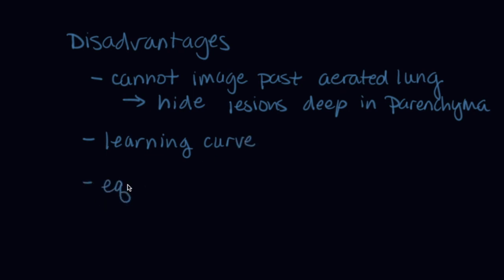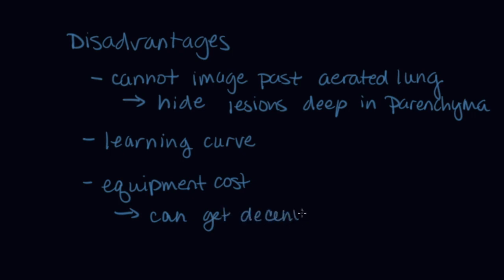And then there's always the cost of equipment. However, due to the shallow depth and the lack of necessity for really good detail, just about any ultrasound can be used to ultrasound the chest in a field situation, even if all you have available is a rectal probe and a repro ultrasound.